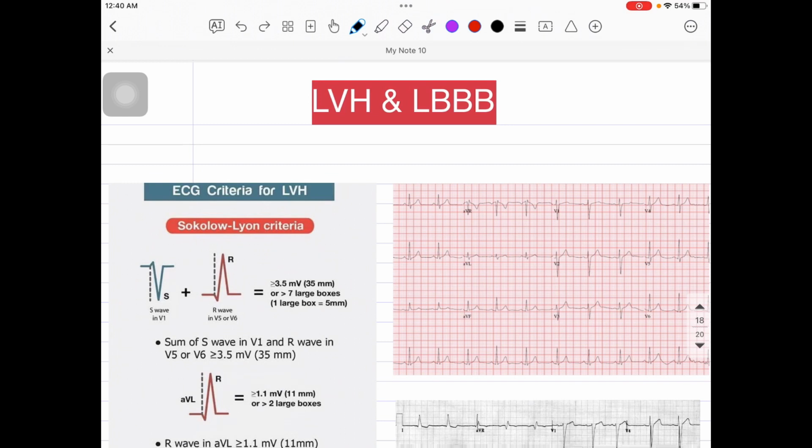So I hope you are enjoying all the other previous videos in this ECG series, and I hope you have already listened to that part. And today in this session we'll try to find out about them. They are not very rare, they're also very common in ECGs. So we'll try to find out how to identify them, and it's easy to find out, right?